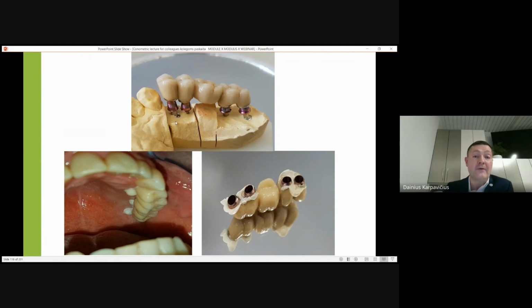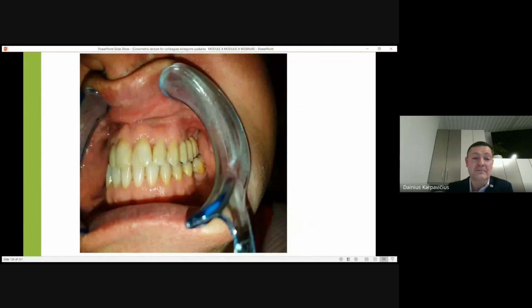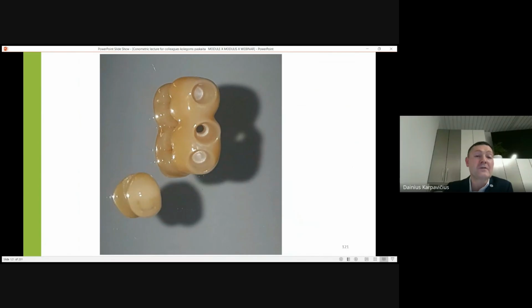because most of our prosthetics are zirconia. And we have again conometric crowns, free from the bridge. We cemented everything in the mouth to have the most passive fixation. Then we refixed the bridge, cleaned everything, nice, passive, without any cement. The bridge comes back to the mouth, no occlusion holes, the most aesthetic and passive, and with the possibility of retrievability. This is what we're striving for in all our prosthetic solutions.